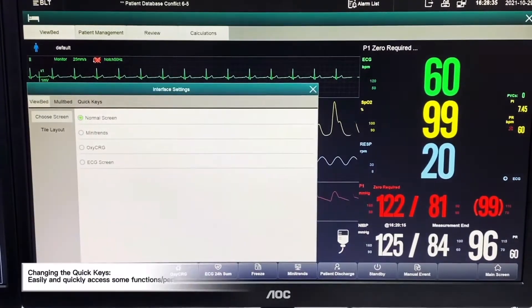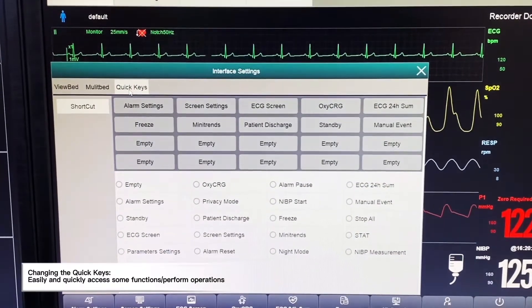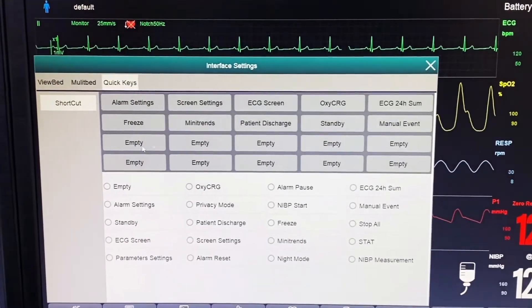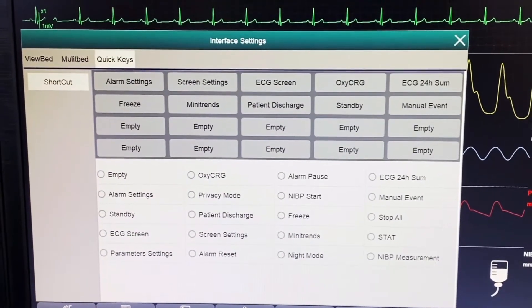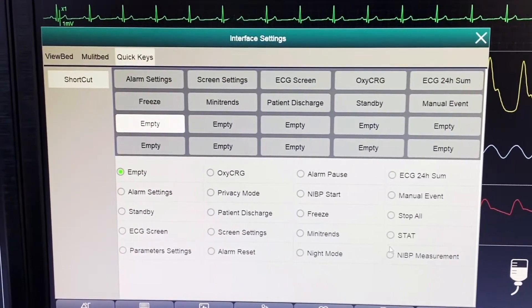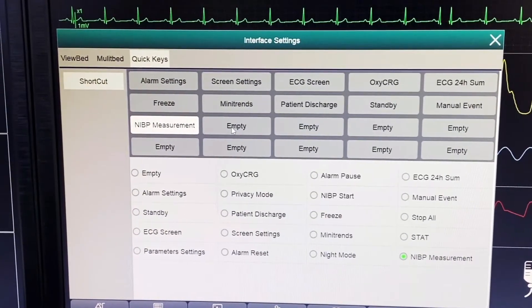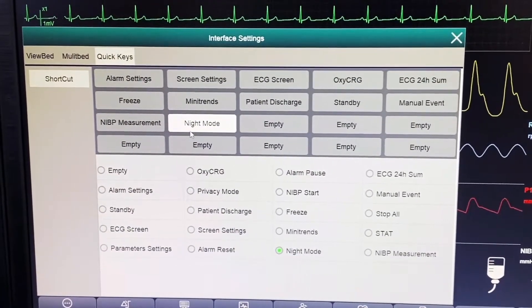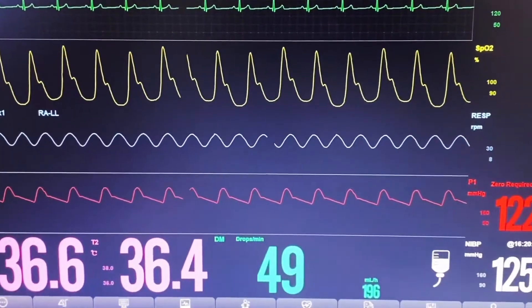We can also customize the quick keys. We click on quick keys, and we can see several default settings. If we want to add quick keys to the manual bar, we choose the location and then select, for example, NIBP measurement. Similarly, we can choose night mode and place it here. After closing, we will be able to see NIBP measurement and night mode on the quick keys bar.